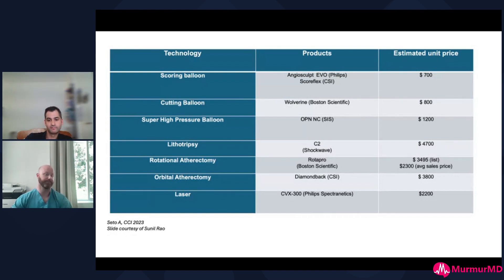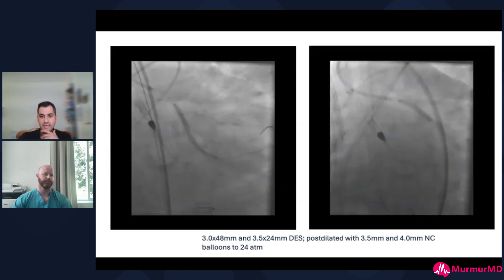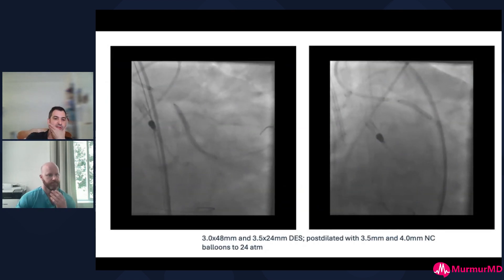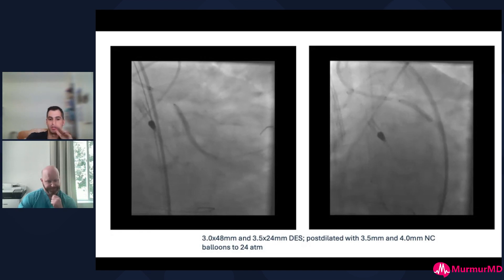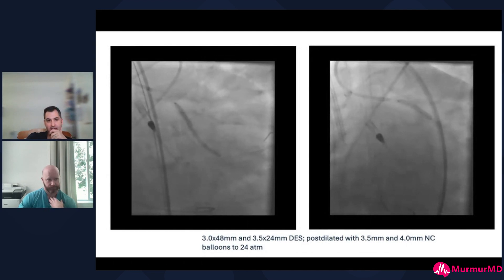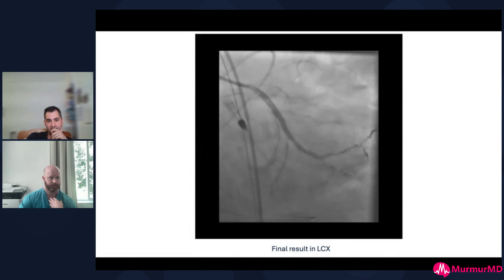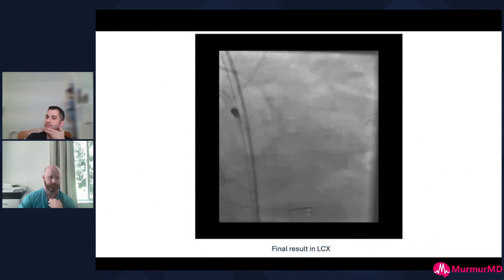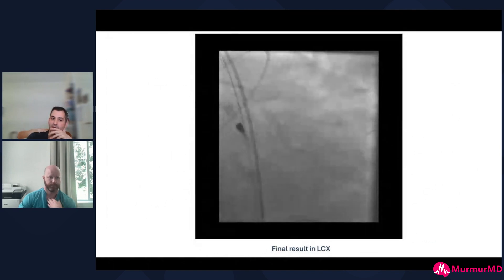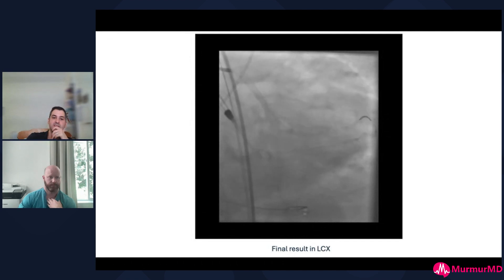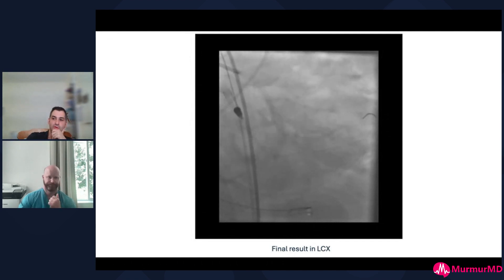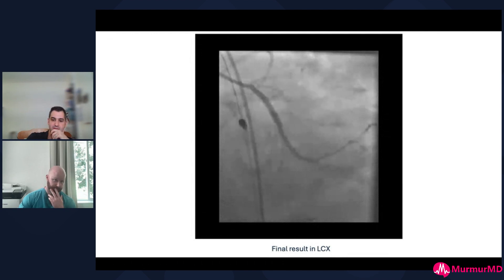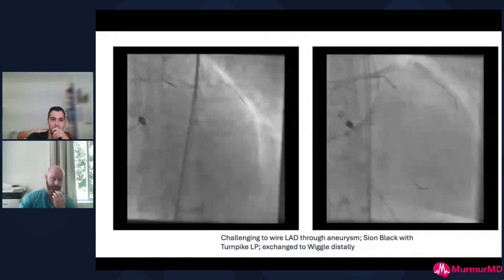We did lithotripsy — took a 3.5 IVL balloon — and had good expansion. Re-imaging showed fractures on IVUS. Then we put in two long large drug-eluting stents and post-dilated. That's the final result in the circumflex: all the distal branches covered, all that critical disease treated. Luckily her left main was spared of significant disease, so we didn't have to get into bifurcation things.